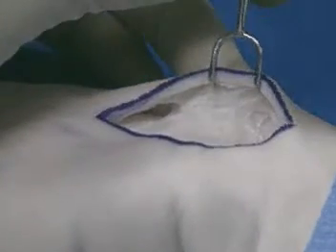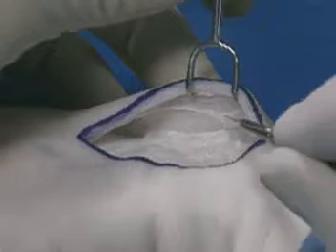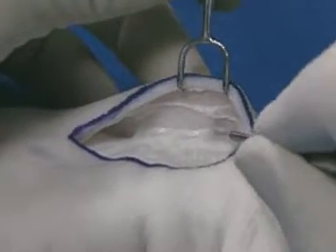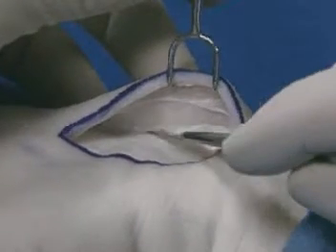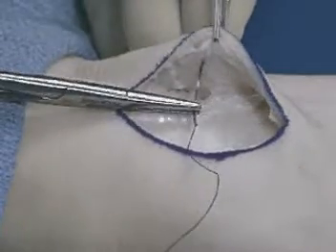A number 15 blade can also be used to continue the undermining. This demonstrates that either a scissor or a number 15 blade can be used to undermine the soft tissues, which will allow closure without tension.